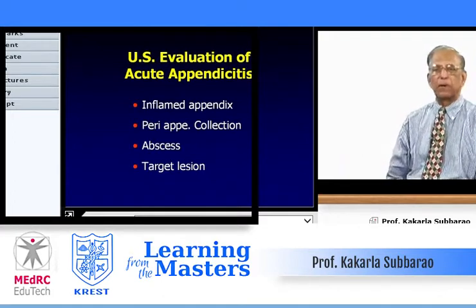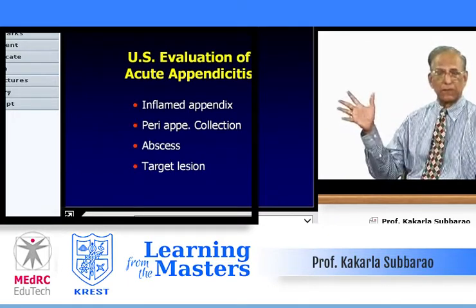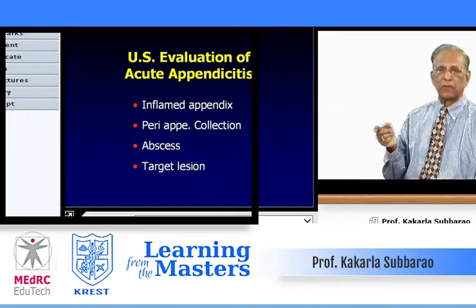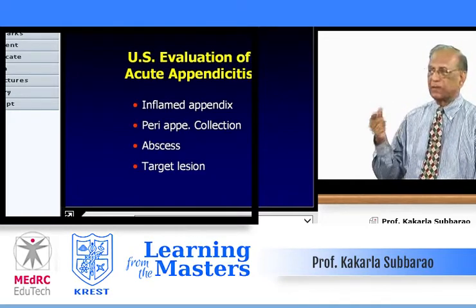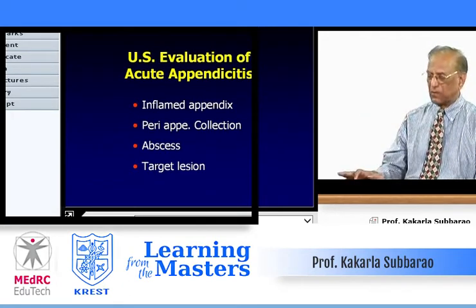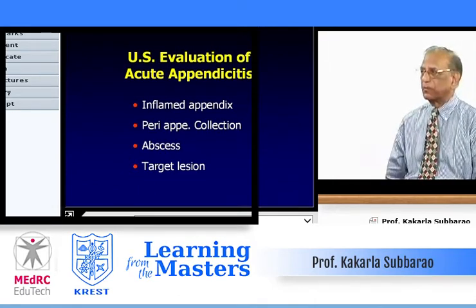And then, the importance of ultrasonography in the evaluation of acute abdomen. The most common cause of acute abdomen, apart from intestinal obstruction, is appendicitis, acute appendicitis. You can diagnose an inflamed appendix, periappendicular collection of pus, abscess formation, localized abscess, and a target lesion. These are some of the imaging findings through ultrasonography.